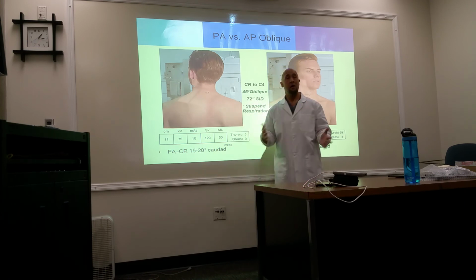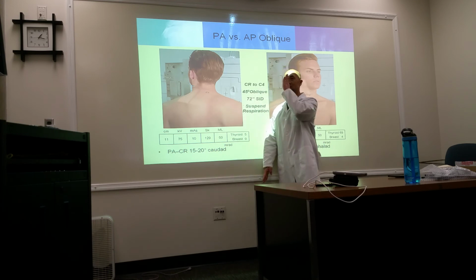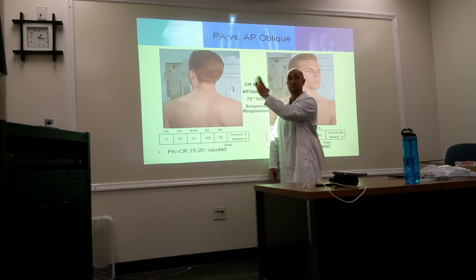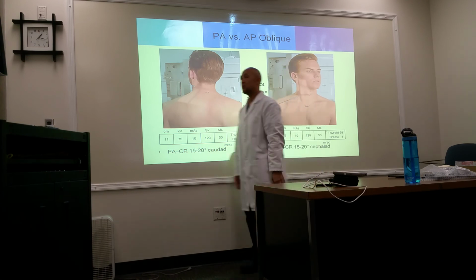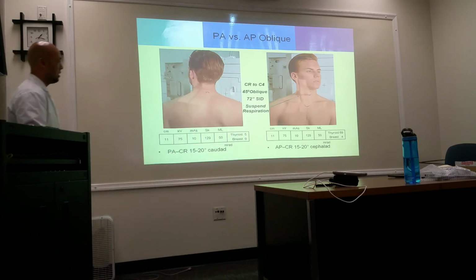Okay? Oblique your patient 45 degrees. I'm not looking this way at 45, I'm looking this way. So body is 45, but head is going to be lateral. We have them tilted up and then turn around. The purpose of turning your head is it removes the jawline from your spine. So that's the whole purpose of turning the head laterally. It moves it away from the spine. Okay? So 45-degree body obliquity and put the head in a true lateral position.